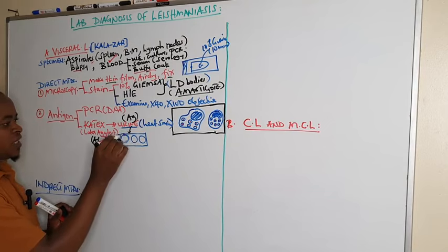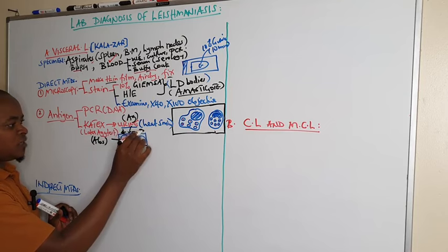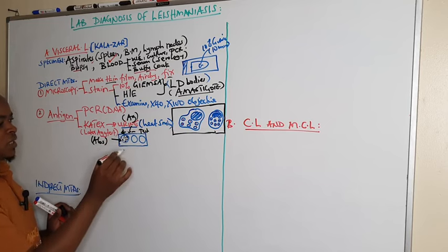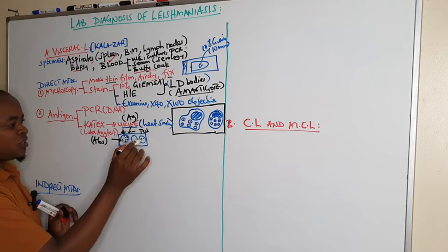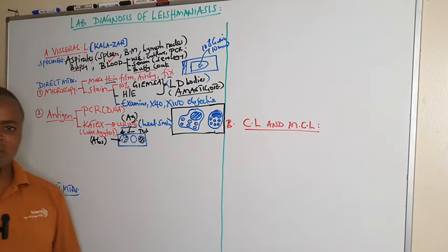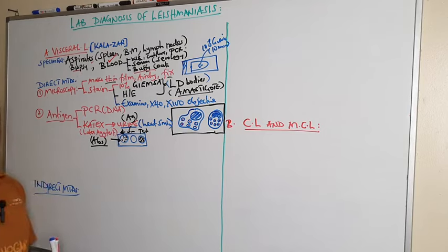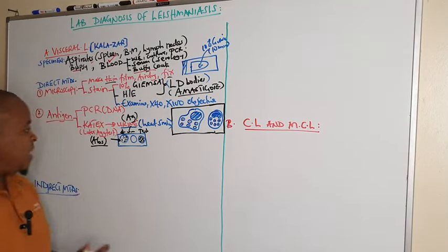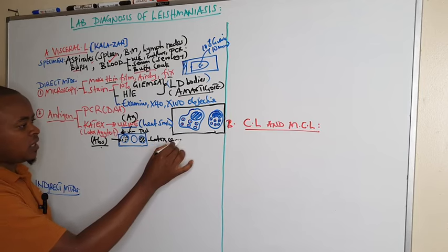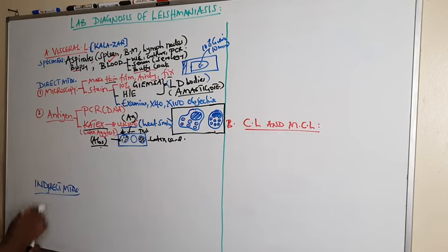that, after adding urine, we must have controls, that is the positive and negative, plus the test. On positive, there must be agglutination. On negative, no agglutination. And on the test, if we see agglutination, this will indicate presence of Leishmania donovani. These antibodies are commercially prepared and immobilized within the reagent. So we find them in the reagent and we put it on a latex card. This is the latex card we are using to determine presence of antigens in urine.